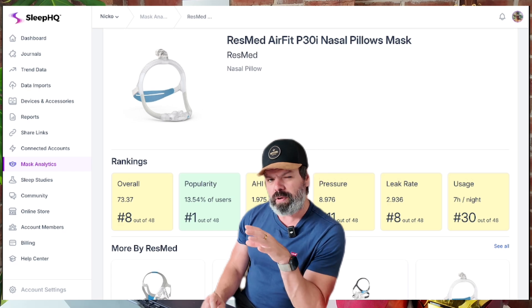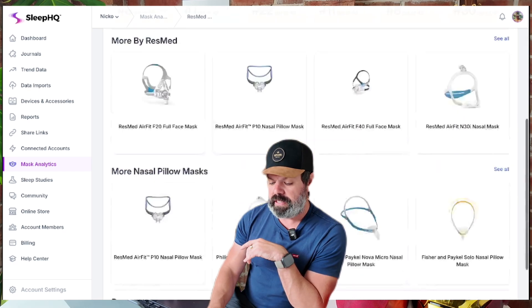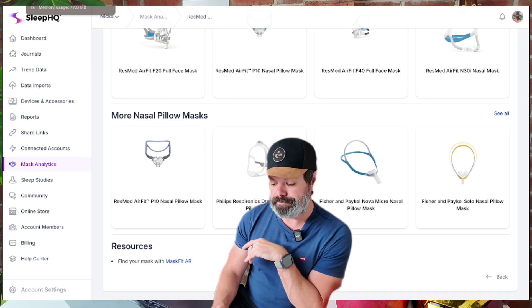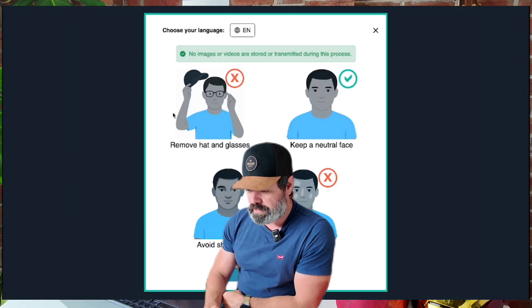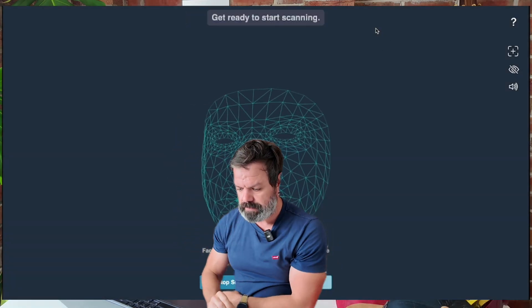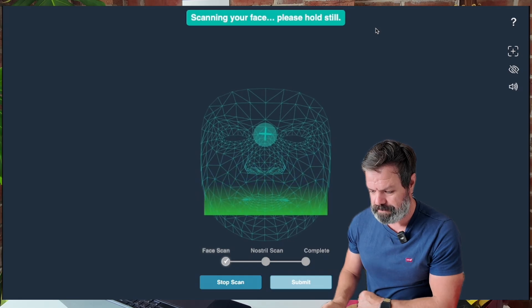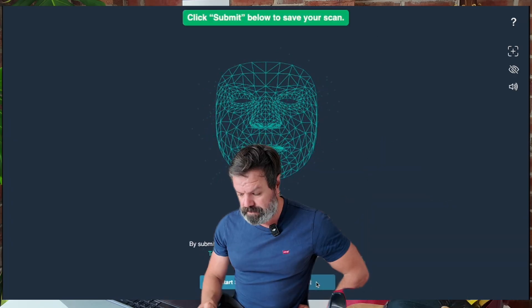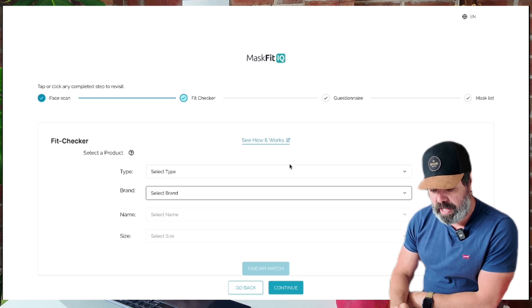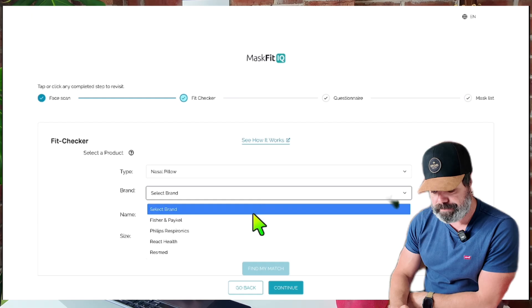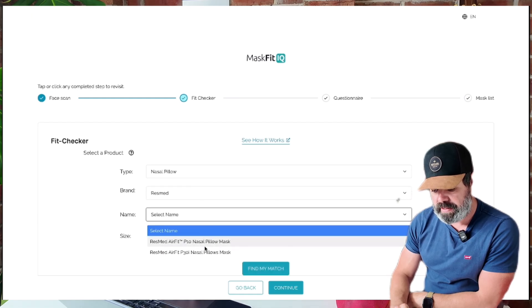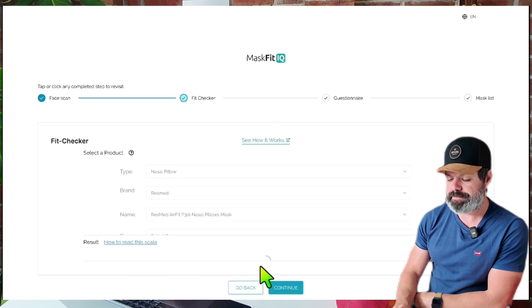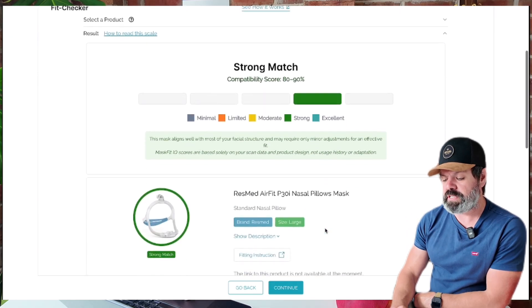Now let's say I'm interested in the P30i but I'm not quite sure of my sizing. If I come down here, it says 'find your mask with mask fit AR.' Click that link and it opens up a face scan — let me do a quick demo. I'll remove my hat... scan complete, click submit. I'll select type: nasal pillow, the P30i, brand ResMed. I'm going to leave the sizing blank because I don't know which size is best. Boom — I've got a strong match for size large.